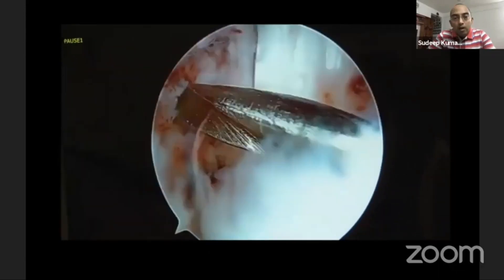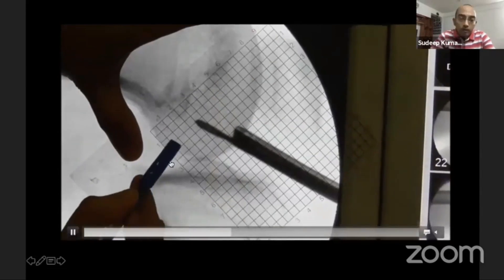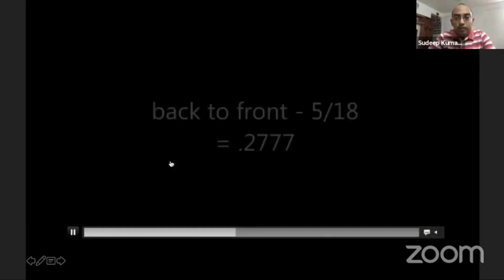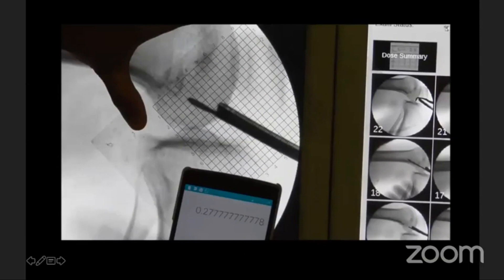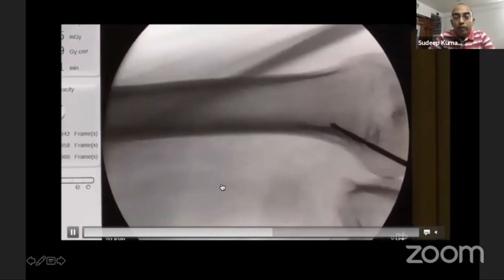The position is two back and two high, so accordingly I change position — coming slightly forward and slightly down. A new shot is taken, showing I'm at 5 out of 18 boxes from back to front, which is 27.7%. For a single bundle, this is anatomically exactly where I want to be. From top to bottom, I'm at 3 out of 8 boxes, which is 37.5% — right on target anatomically.